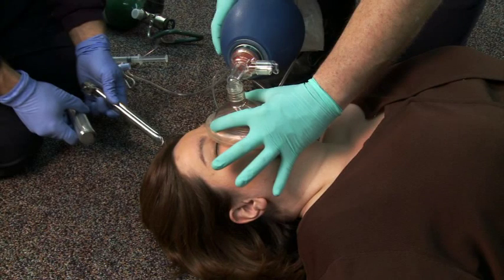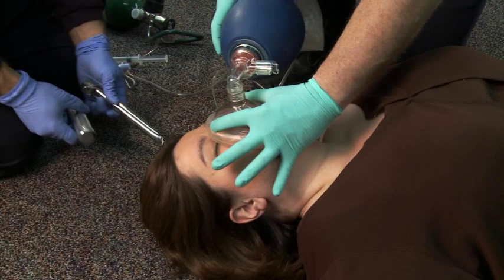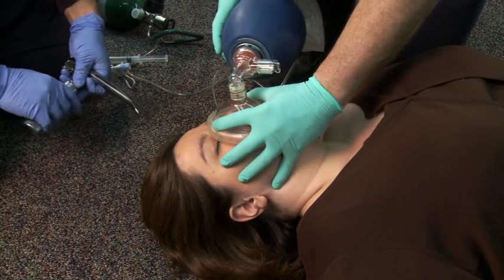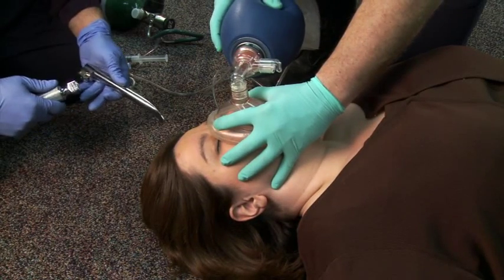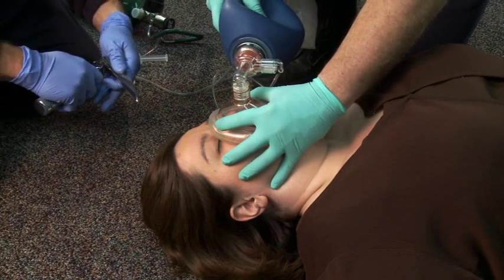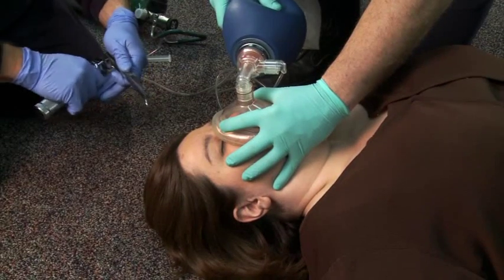This video will demonstrate oral endotracheal intubation. The first provider assists ventilations, while the second provider assembles and tests the equipment.